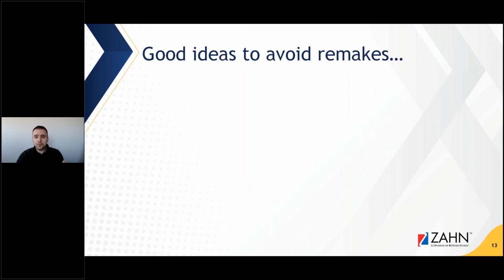Our file retrieval department is probably the most interesting department because that's where all the files come in from multiple customers, and you really need to pre-filter what's coming in and assess what's good and what's not, and maybe send it back if it needs a new scan or readjustment.